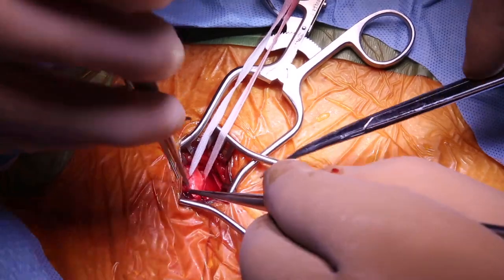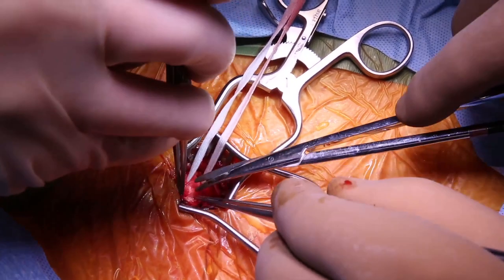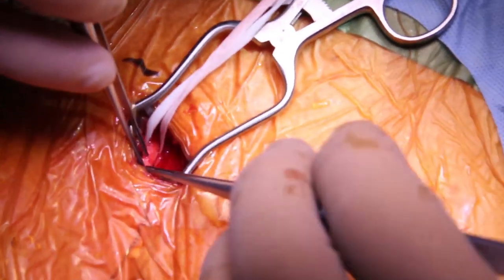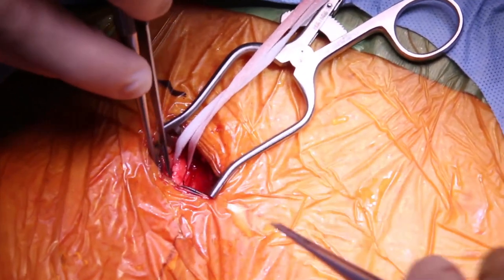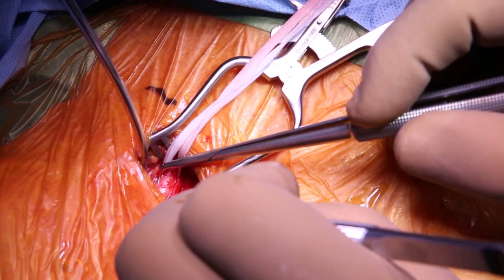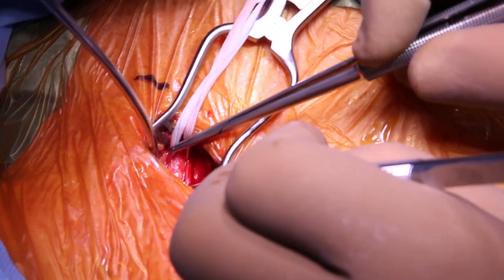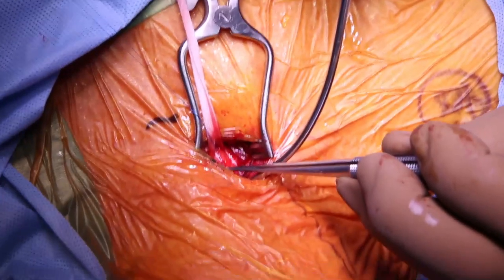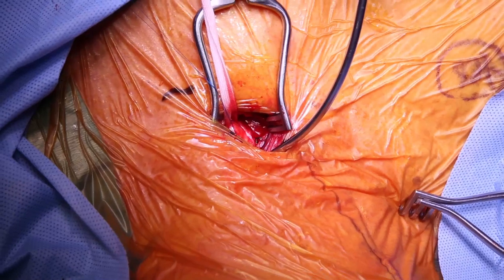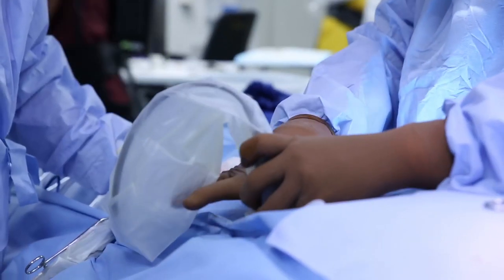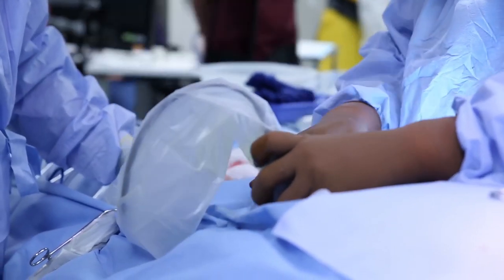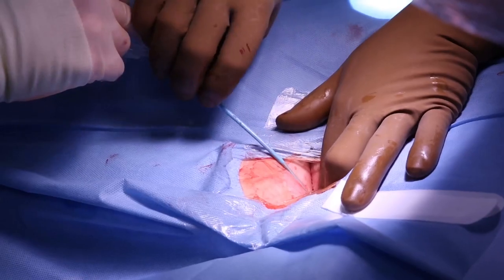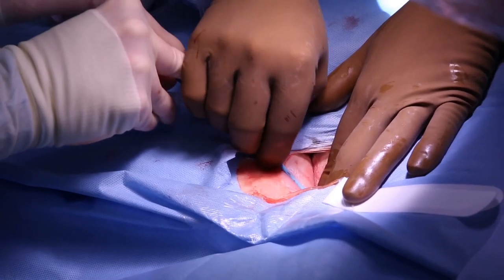A 5.0 prolene suture was placed in U-stitch fashion in the anterior wall of the common carotid artery, to be used for later micropuncture access and placement of the arterial sheath for flow reversal. Attention was then turned to the contralateral common femoral vein where micropuncture access was gained under ultrasound guidance.